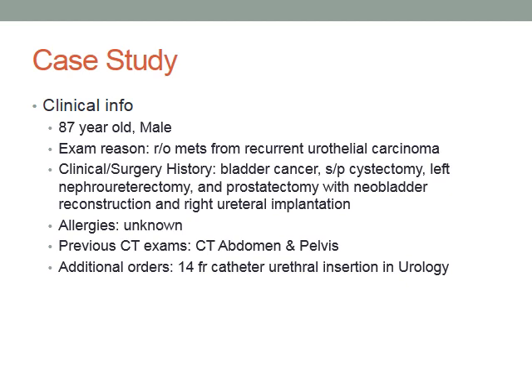Fluoroscopy might be used for this case as well. However, we would not have axial images or MPR and other reconstructions available for evaluation.